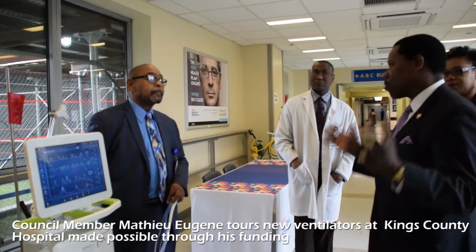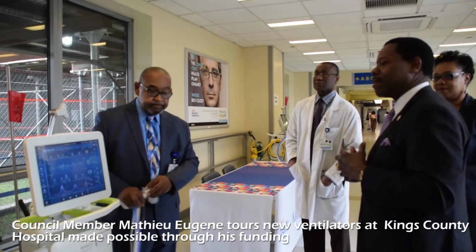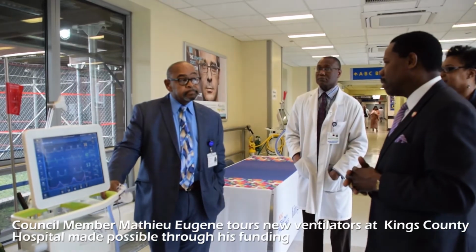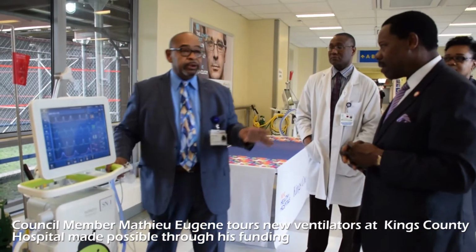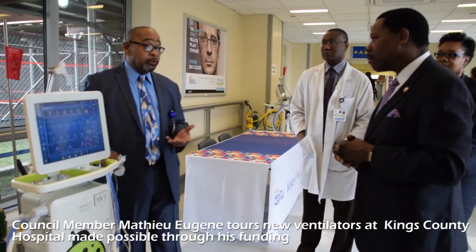Technology is about software, right? That's right. Software and computers. In case the system is down, is there any alternative? What is the backup plan? Nice question. If there's going to be a glitch in the software, the ventilator will tell you that. It will give you an alarm. It's something we call the technical error code.